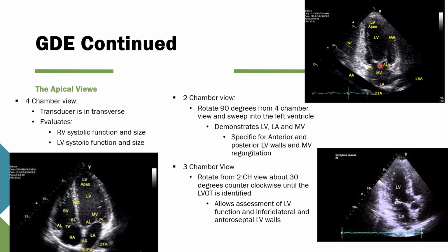If you're doing a true ejection fraction, you'd also take measurements in this sagittal view, as that would complete the calculation for your ejection fraction. And again, where here you're evaluating the interventricular septum and the lateral wall, here you're going to be evaluating the anterior wall and the posterior wall. So this is a very effective evaluation if you want to include it in your protocol.